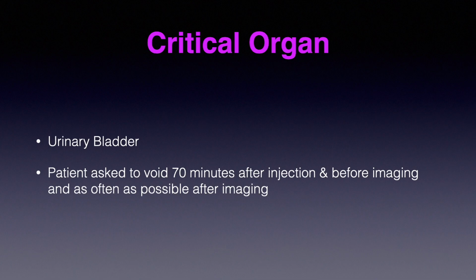The critical organ for this examination is the urinary bladder. The patient is encouraged to void as frequently as possible, and to void 70 minutes after injection and before imaging, and as often as possible after imaging.